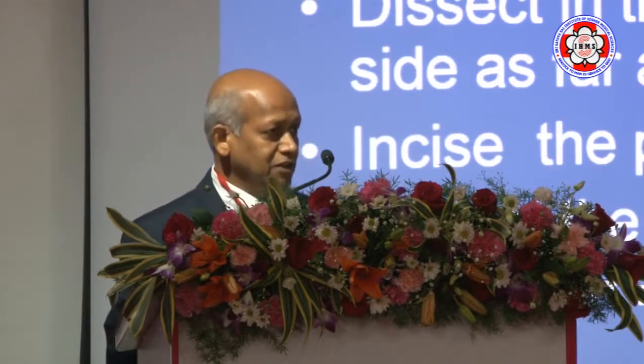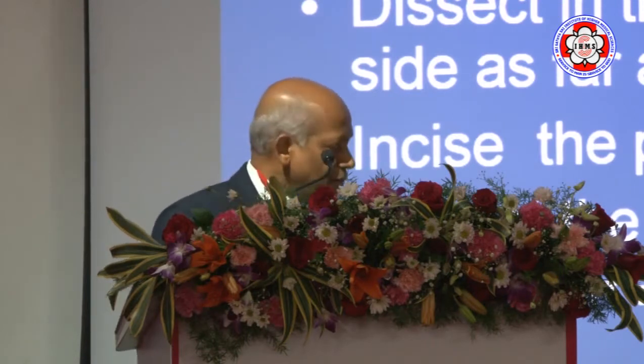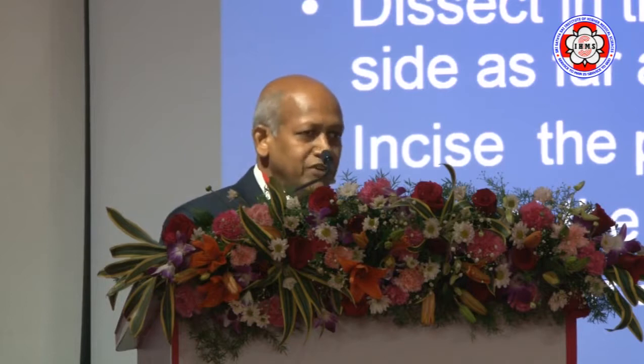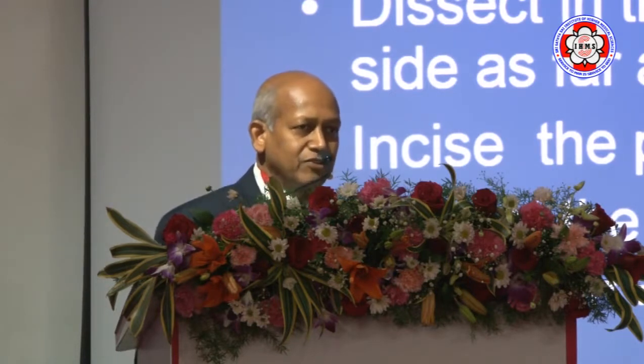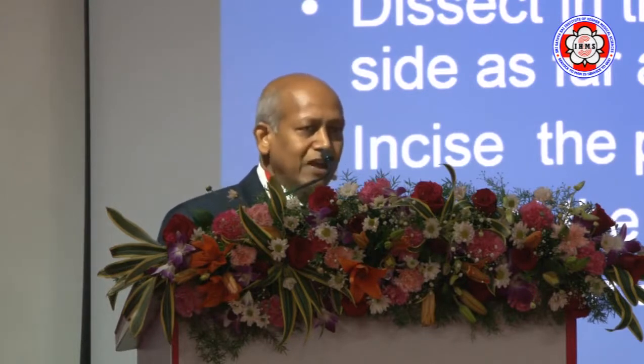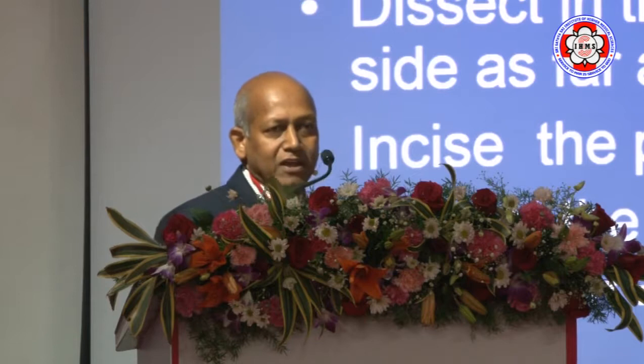The difficulty is then you dissect the cava. You do an operation, that's not the first operation, that's not the last operation. They're going to come back for a second or third operation. So if you make any incision in the body structure, it's going to leave scar tissue. So if you can leave an anatomy which is much more conducive for a second operation, third operation, I like to do that.